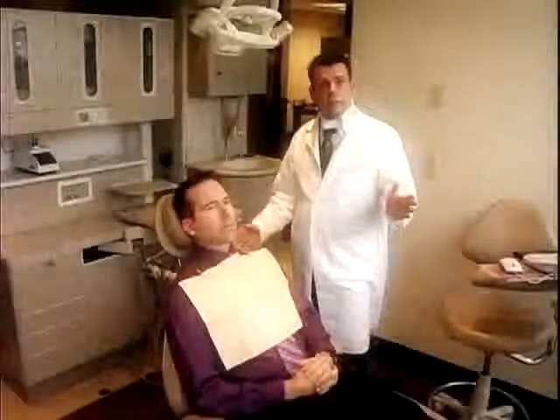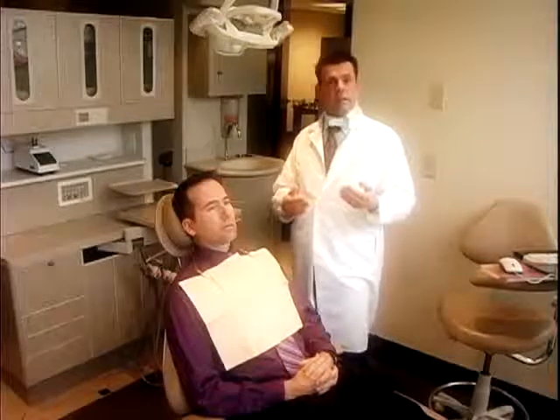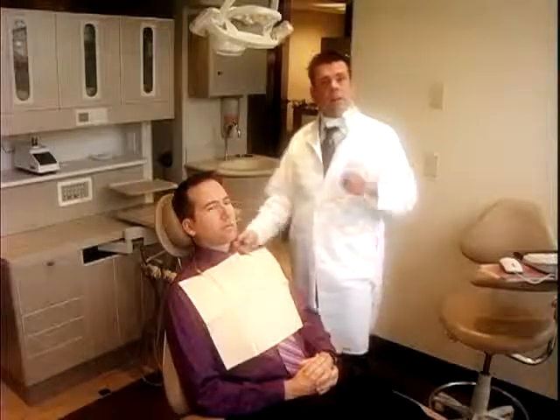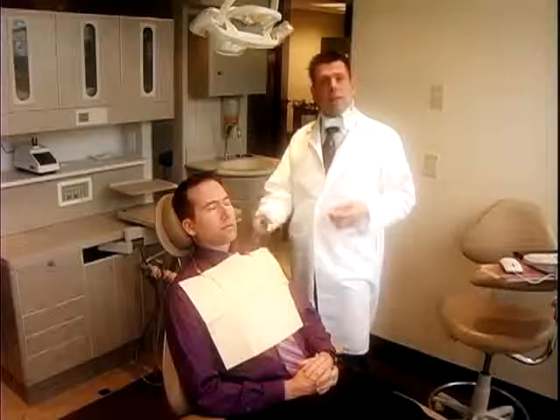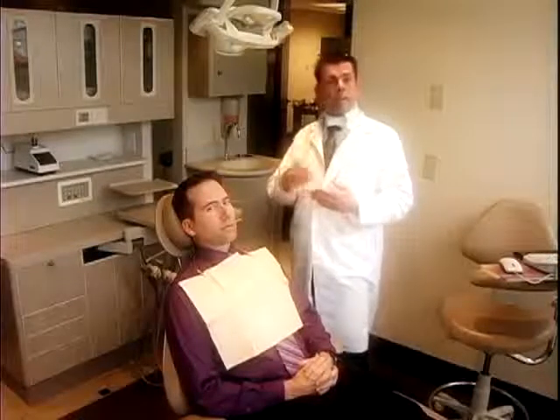This is one of the most exciting procedures I offer at Broadmoor Dental. It's called the cosmetic simulation, and what I'm actually doing is placing material on our patient's tooth structure so that he can appreciate what a change in his smile would mean for him. For Randy, he has some spaces between his teeth, and this has been his objective, to get those spaces closed up. What you'll be seeing in this procedure is me laying down material temporarily so he can visualize what it would mean to do so.